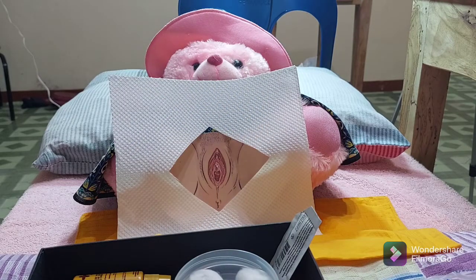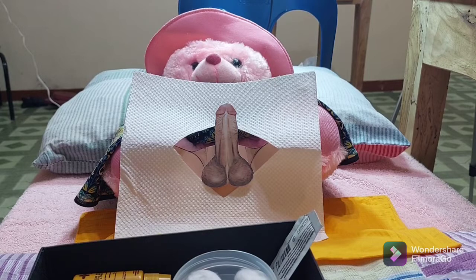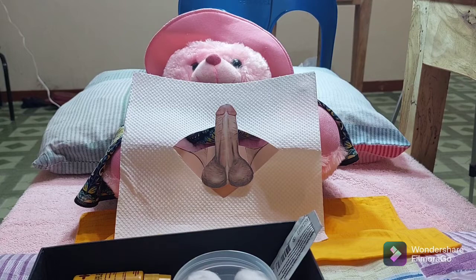And in male patients, gently grasp the penis at the shaft and hold it at a right angle to the body throughout the procedure with the non-dominant hand.